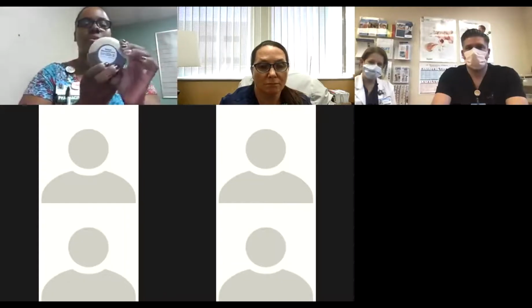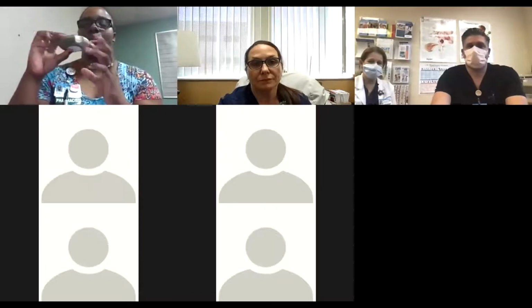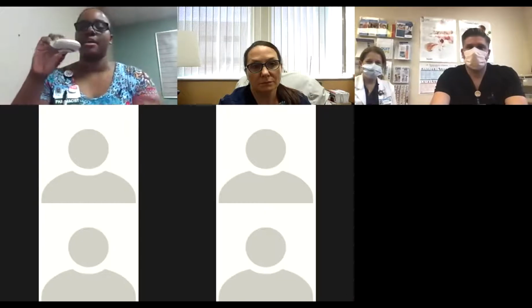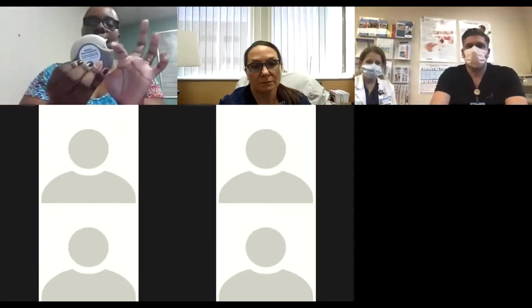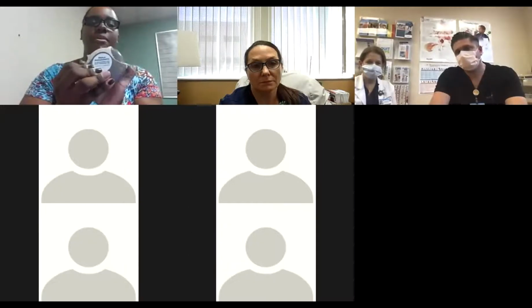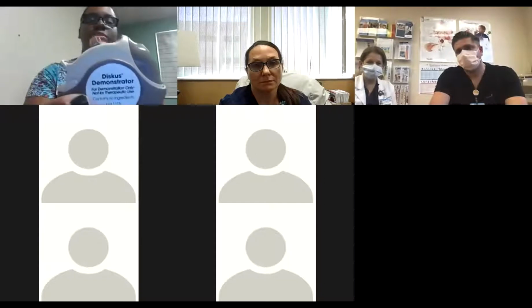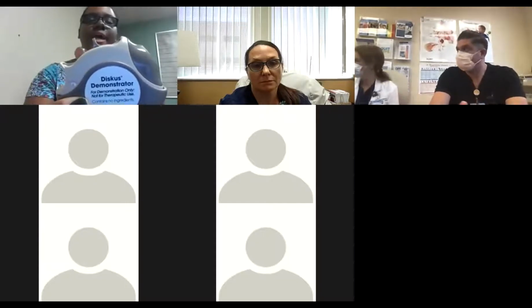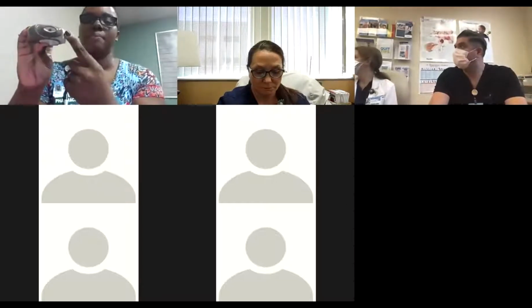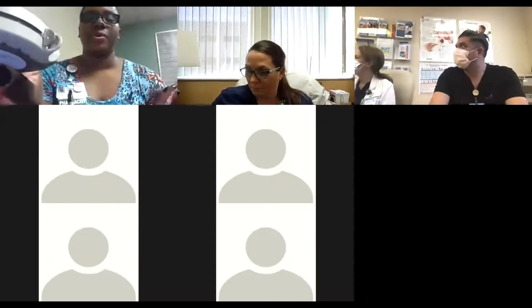So the way that this works, I kind of liken it to holding it like a hamburger. So you kind of want to hold it sideways like this. And then when you look here, there's a slot for your finger, and then you just want to open it. So when you open it, you'll see this mouthpiece, and then you'll see this little lever. This lever activates the dose. So as I mentioned before, hold it like a sandwich, pull it all the way back until you hear a click. Hopefully you heard that click.